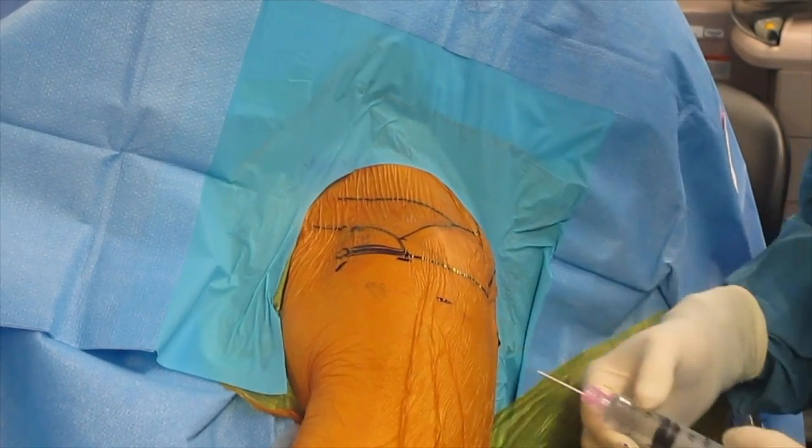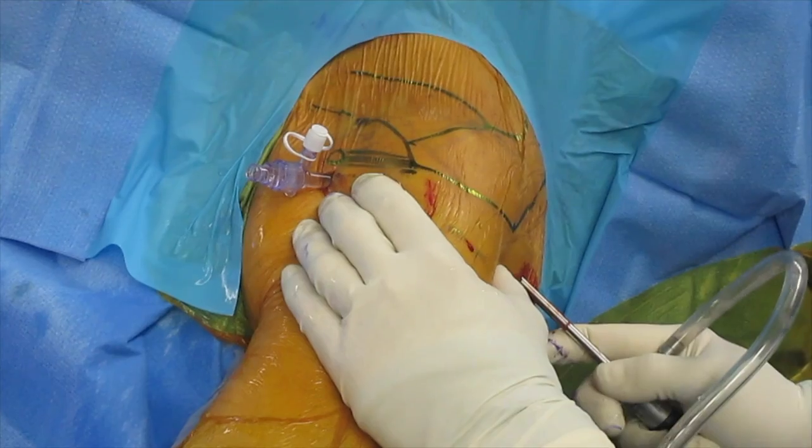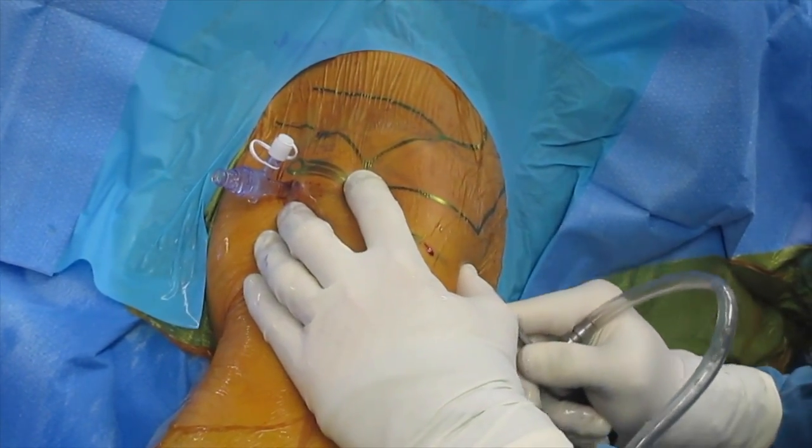At the completion of the glenohumeral diagnostic arthroscopy, the arthroscope is withdrawn and the blunt trocar is reinserted. The sleeve and trocar are then withdrawn to the plane between the infraspinatus and the posterior deltoid.